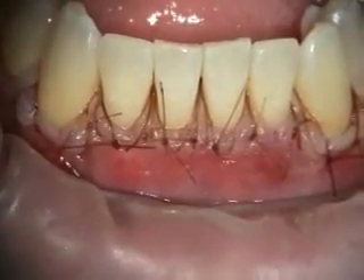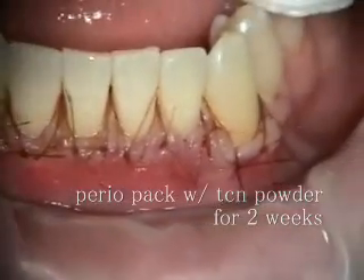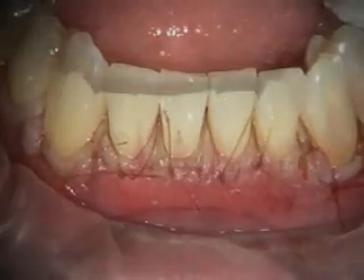So there's our suturing — generally we're doing interproximal slings and then marginal slings, what I call marginal slings, to coronally reposition the gingival margin. We'll take a look at this in a couple of weeks.